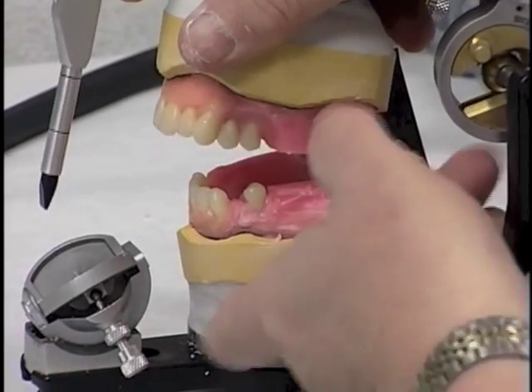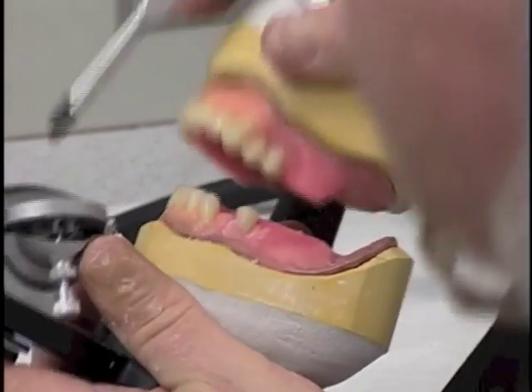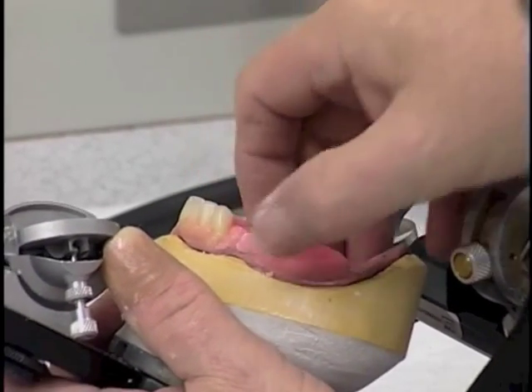And now we're going to close the articulator and see that that tooth is a little bit too far to the mesial. So we want to move it distally a little bit now.